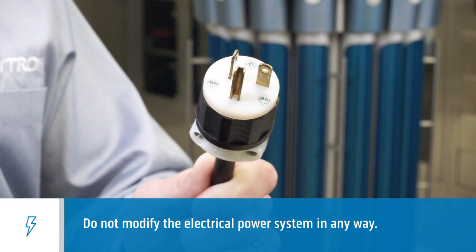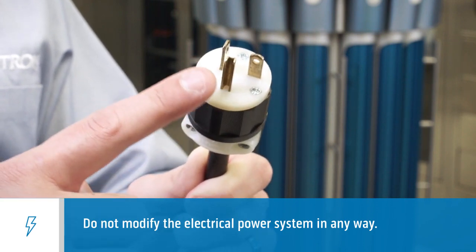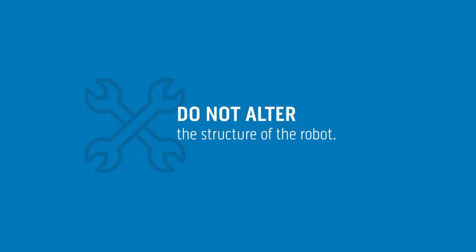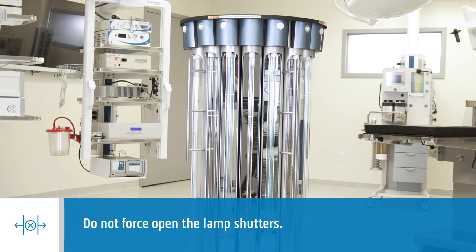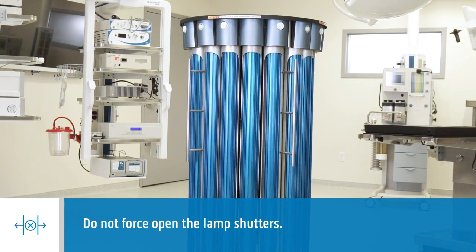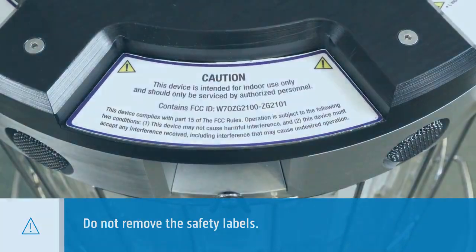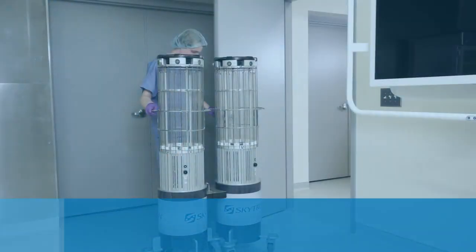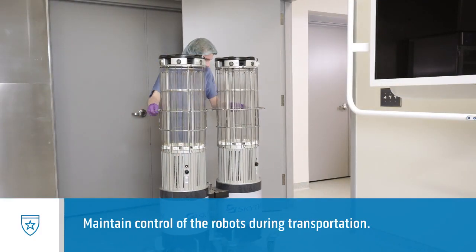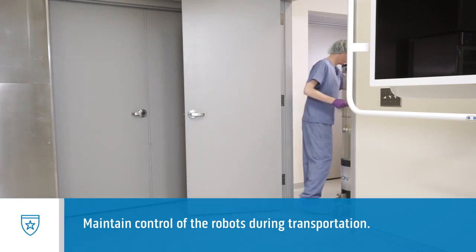Don't use power adapters or power strips, and don't alter the power cord or plug. Don't attempt to alter the structure of the robot, and don't intentionally force open the lamp shutters on the IPT 3200. Don't remove the safety labels. Never leave a robot unattended on an incline even if the brakes are engaged. It's essential to maintain control of the robots during transportation, and only people with the appropriate physical strength should handle this task.